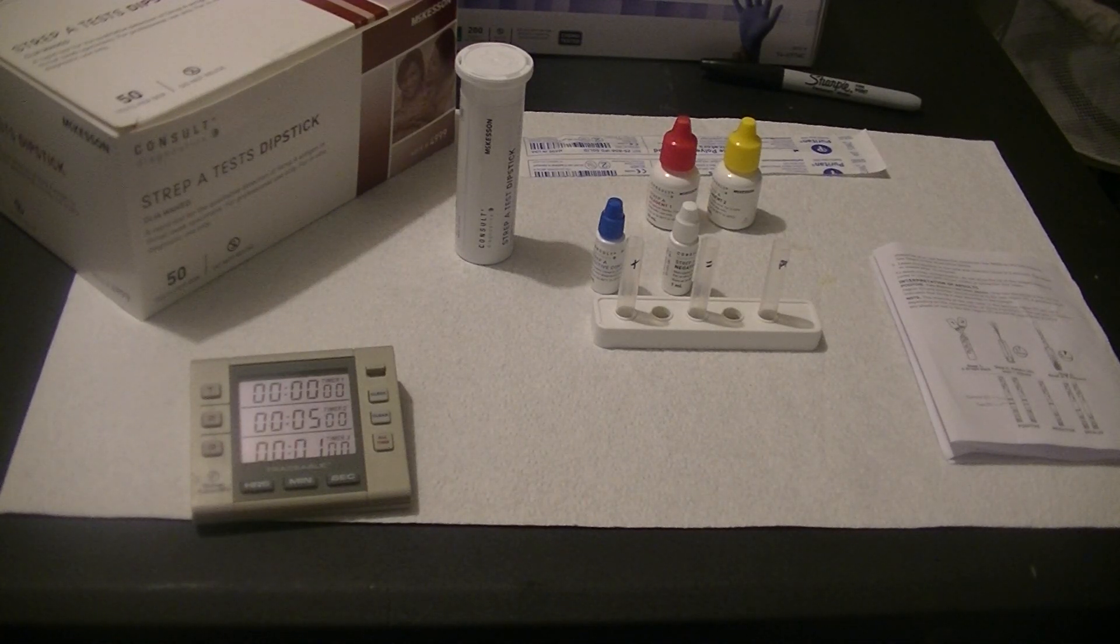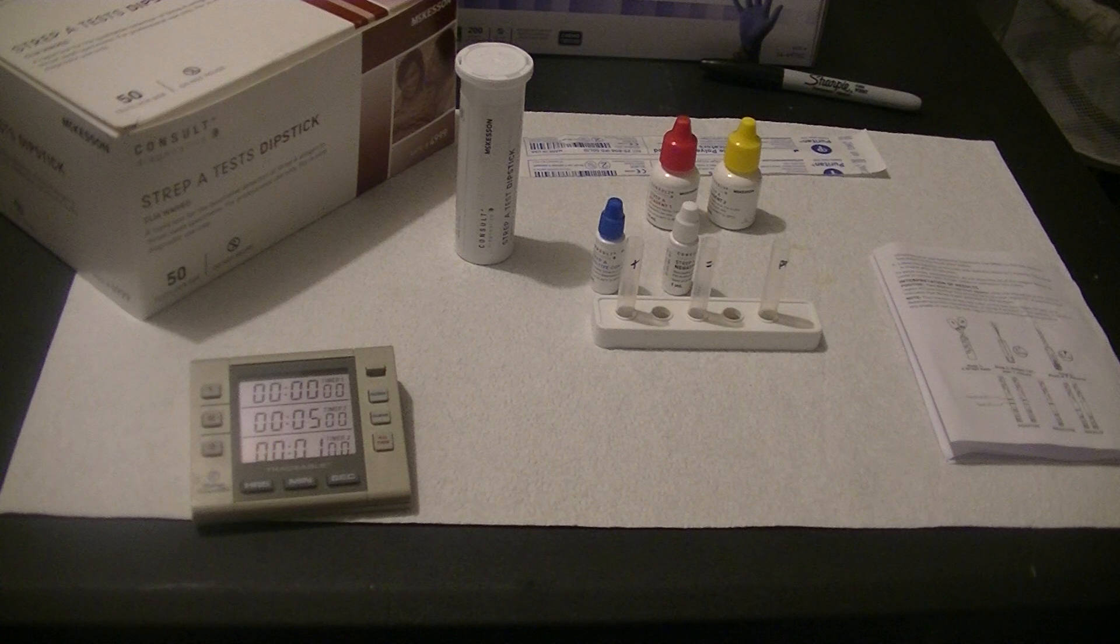The next test I'm going to show you is a strep A dipstick test. This is the throat swab rapid strep test.